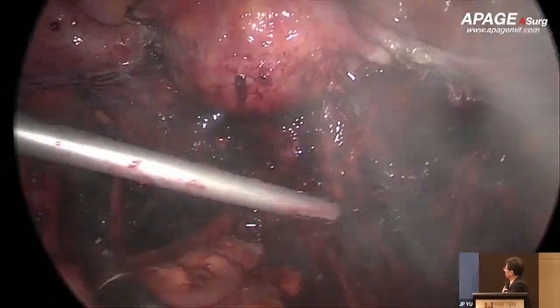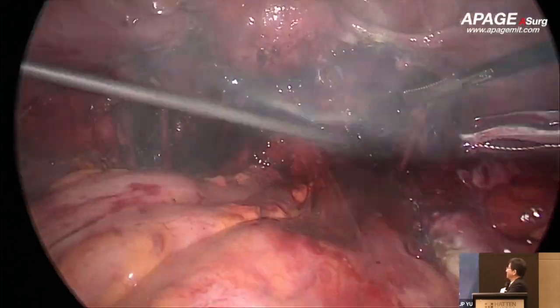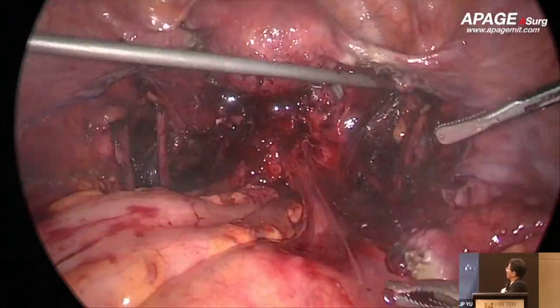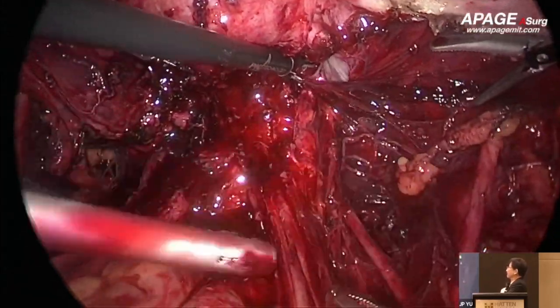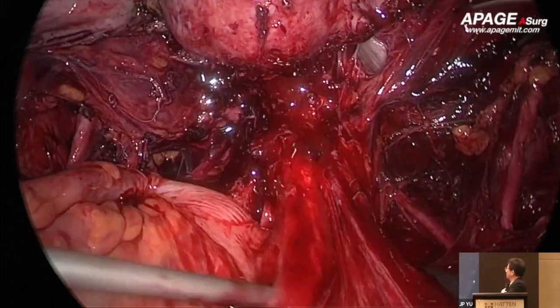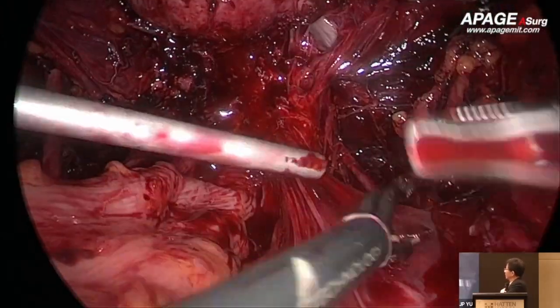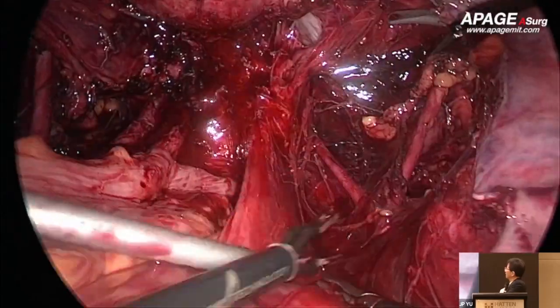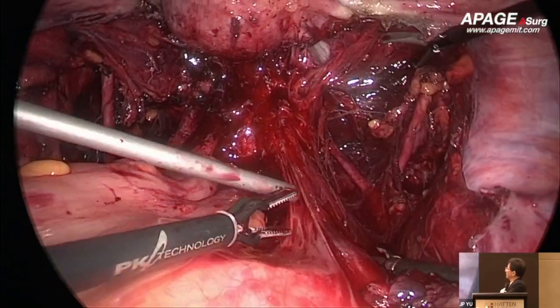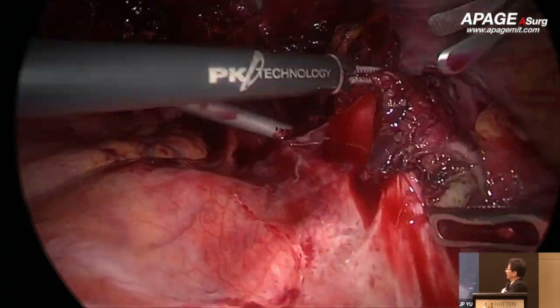Okay, so you can find this video is a little bit different from our videos before. Our videos before are all clear. We can't see any blood. The blood loss is always less than 100 mL or less than 50 mL. But in this case, because of deep endometriosis here, we can see the region just attached to the posterior cervix here. So all the structures inside are just like in an inflammatory status.